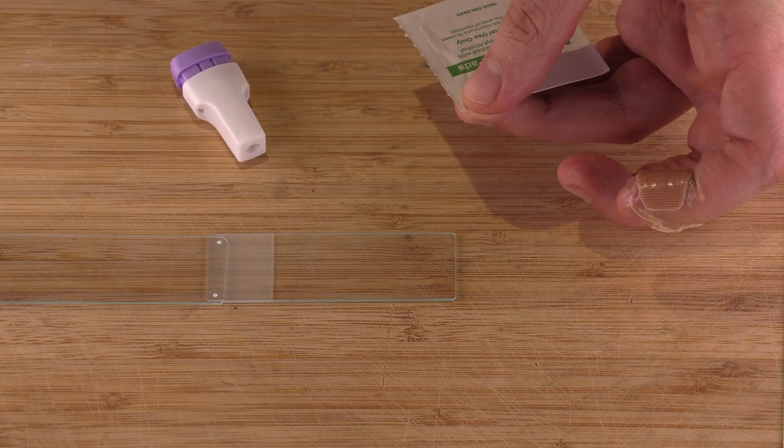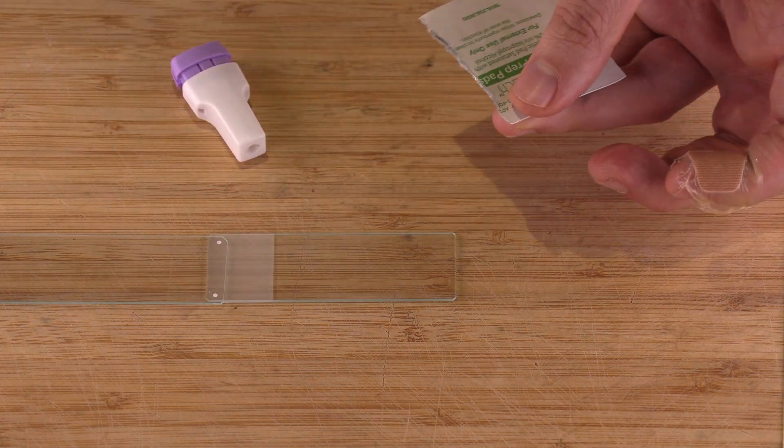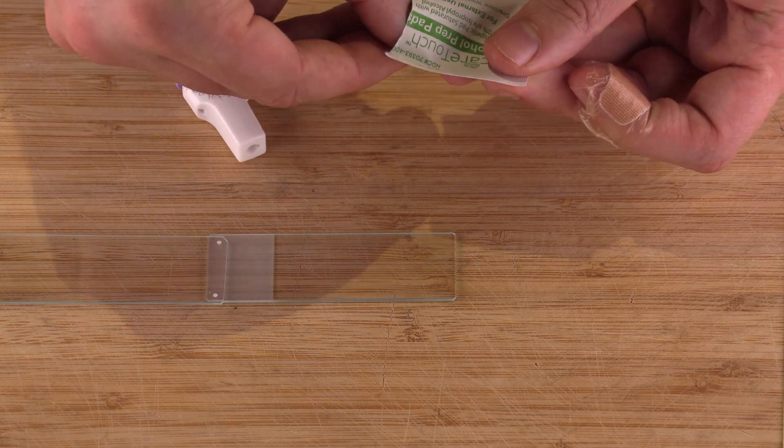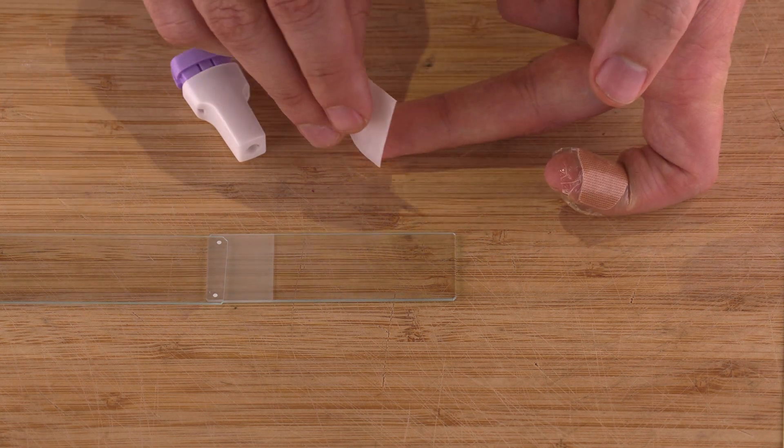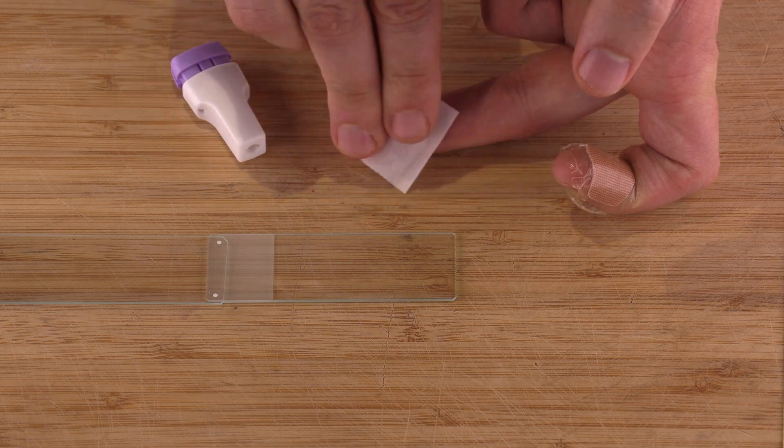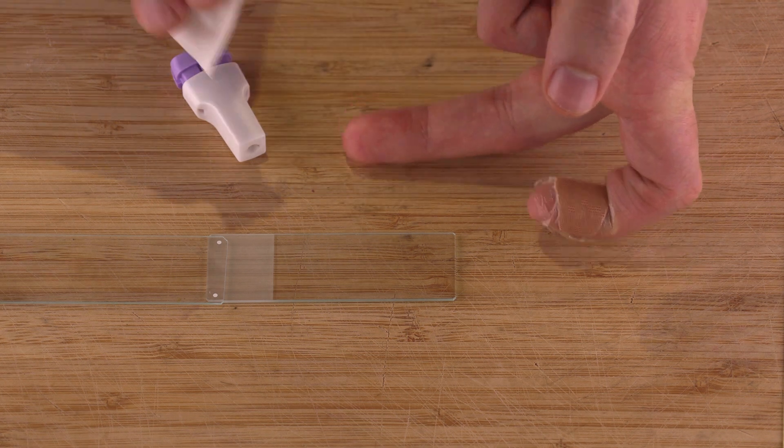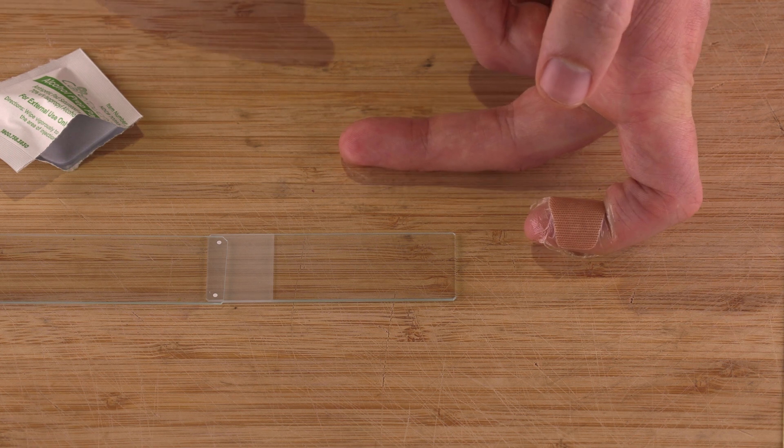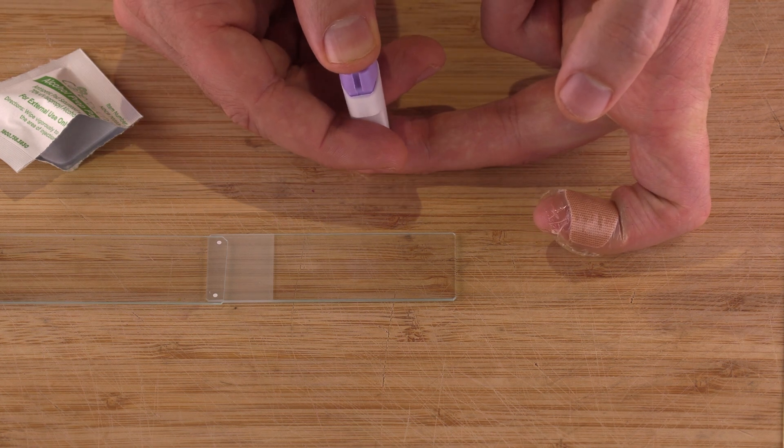Now what I'm going to do is I'm going to use the alcohol wipe that's included in the kit and I'm going to make sure that my finger is nice and clean and I'm not going to get an infection. And then I prepared a second alcohol wipe right next to this. You'll see why in a sec.